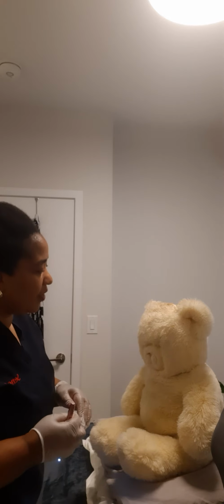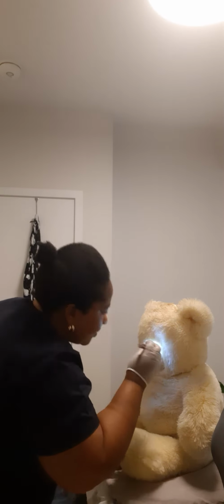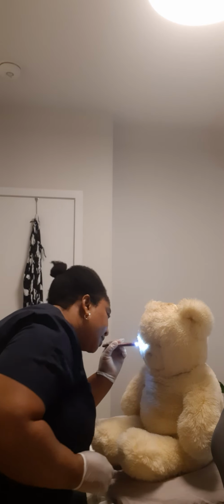And for the direct and consensual light reflex, I'm going to put my light here and bring it to this side and from this side.